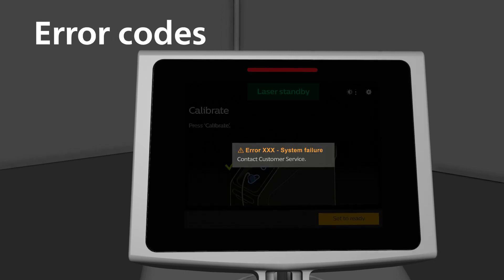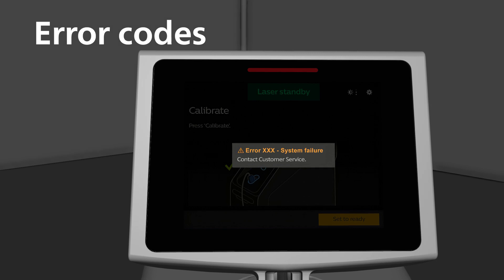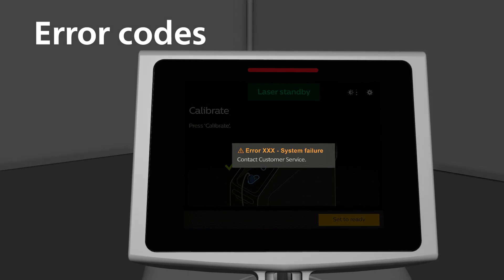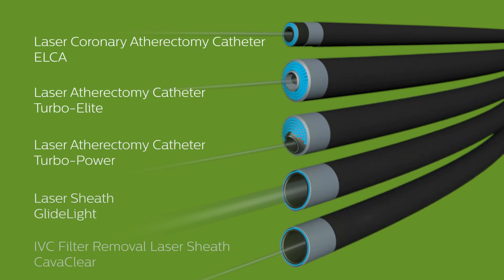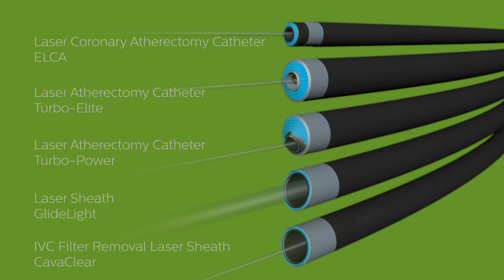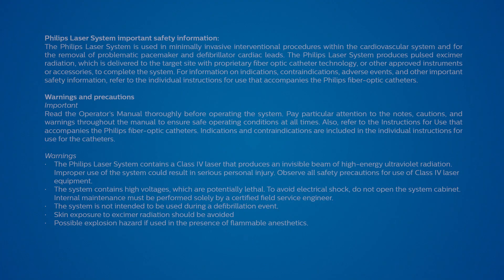When the system detects a fault, a code number appears in the middle of the display window corresponding to the appropriate error. Refer to the troubleshooting section of the user manual and always record the fault code number in your report to Philips customer service. The Philips laser system Neximer is compatible with a variety of laser catheters across specialties for a broad range of use. Treat more complex cases faster.